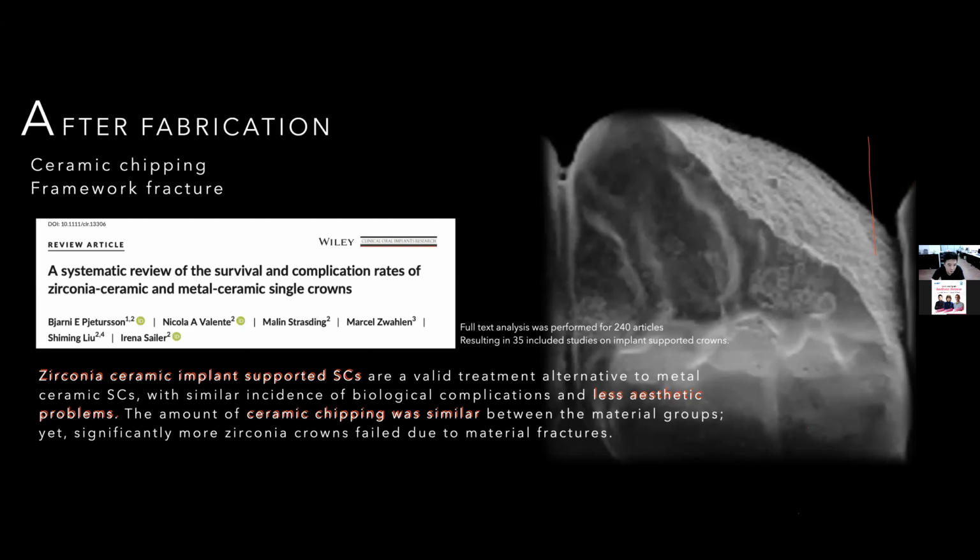Especially for the full mouth case, the patient's bite and occlusion is not stable. He will check and test to find the position where he is more comfortable. So sometimes when you finish this case with the porcelain work, you will very easily get it back to repair.